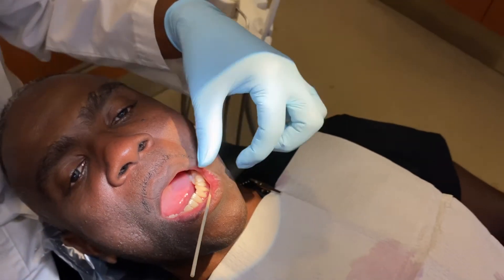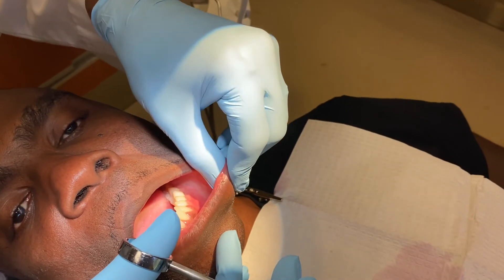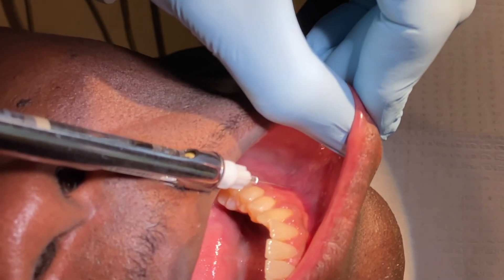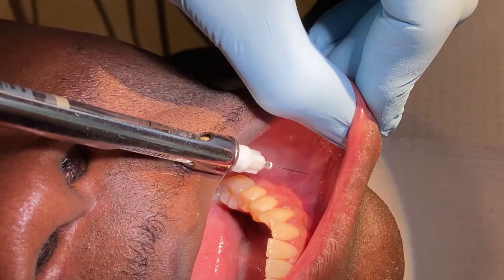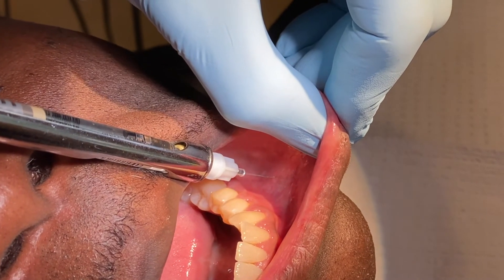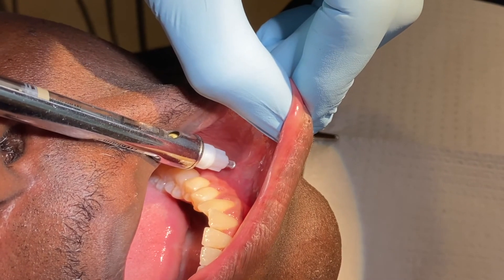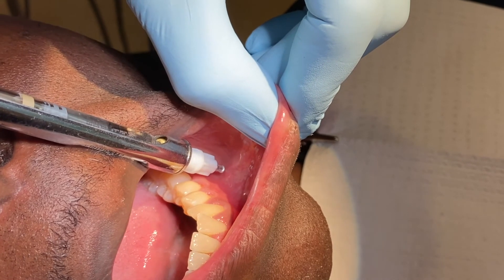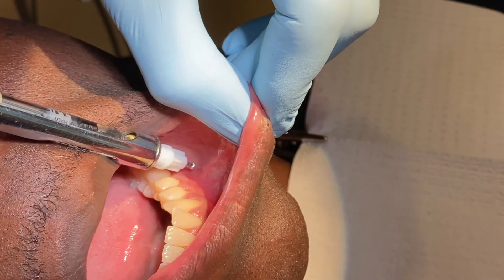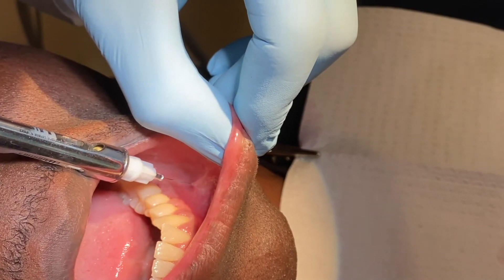We'll fast forward five minutes and remove the topical. I'm using a 30 gauge short. I'm going to pull the patient's cheek way out so I can really see the depth of the vestibule. I'm not going too close to the mandible because I don't want to hit bone. I'll come slightly out to the depth of the vestibule and lightly inject just superficially, a little bit of anesthetic. Then I'll slowly bury down to the hub of the needle and inject the remainder of the carpule. I like to save about a quarter carpule to inject slowly as I'm coming out, and we're done.